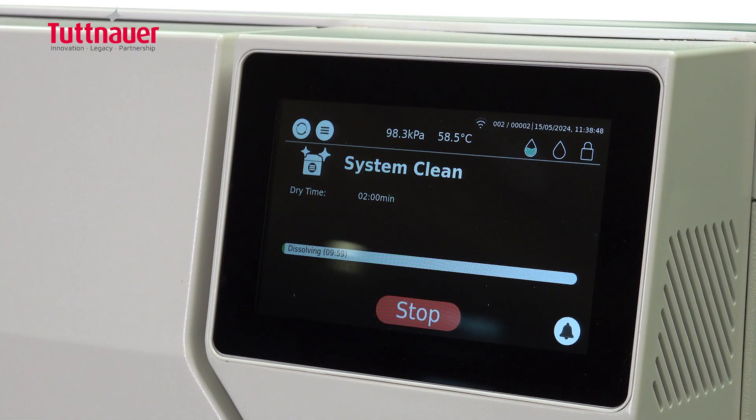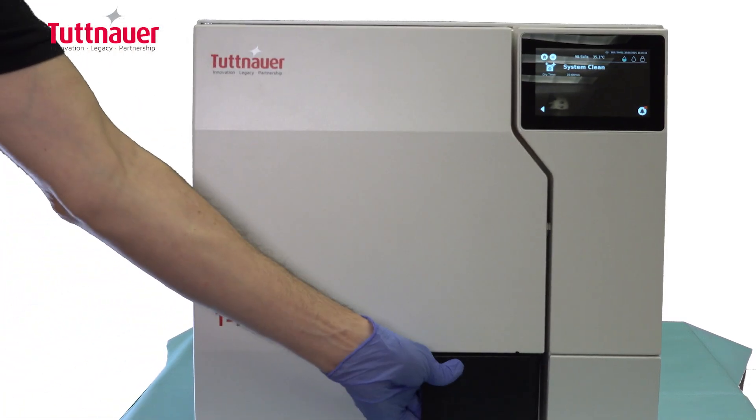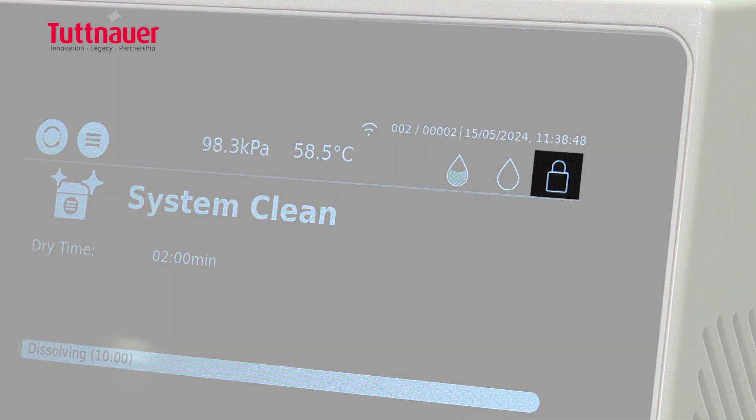The T-Top door always remains locked for the duration of the cycle. Only filtered air enters the chamber to ensure loads are always sterile.